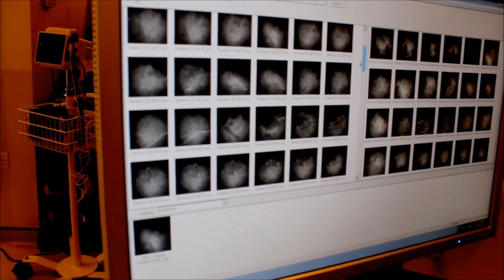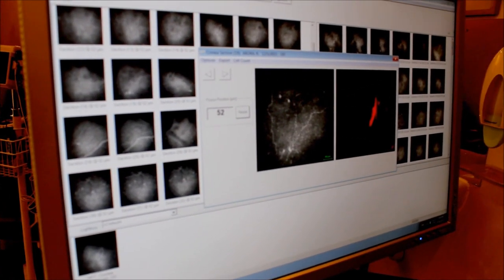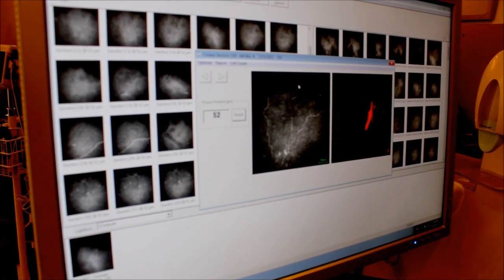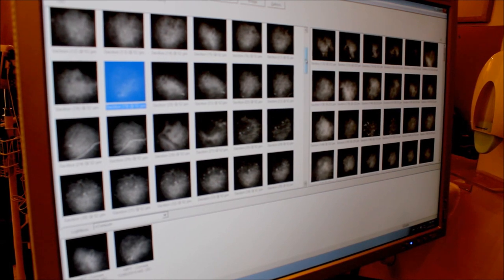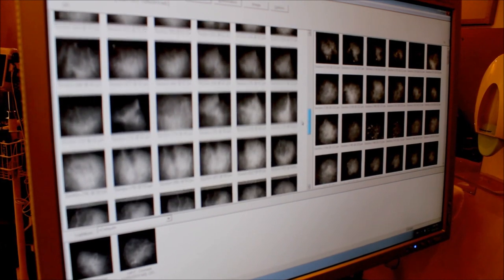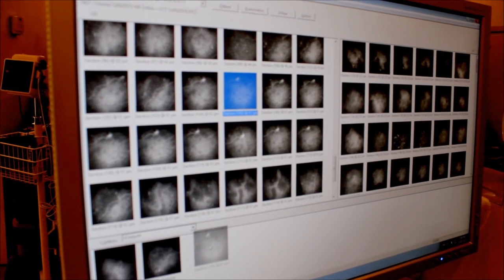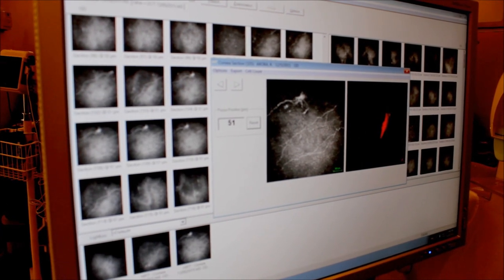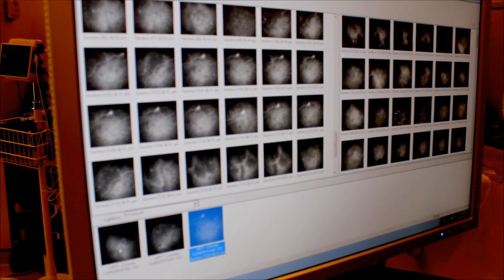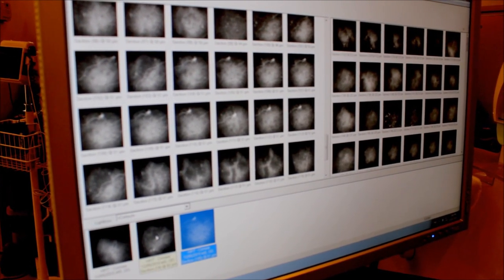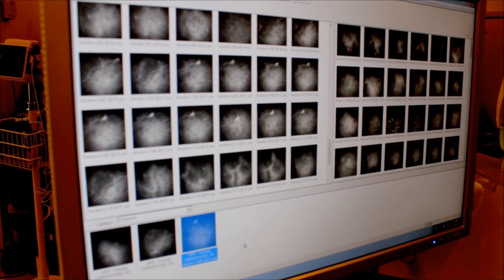Looking through the images, I identify other images which are not as low, but not very high as well — let's say this image, where we can see two nerves and a branch. So I would choose this image. And then I will go and choose the image with the highest density, which in my opinion would be this one, where we can see about four nerves. By using this method, what we create is a range of a minimum, a maximum, and an average image, which we have found and published on, that this represents as close as possible the true density of the nerves in the patient.